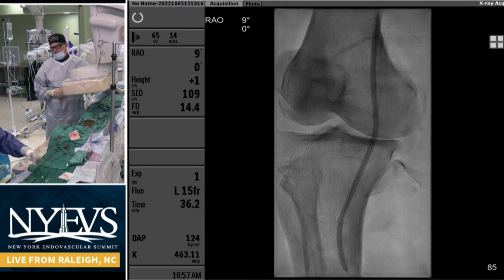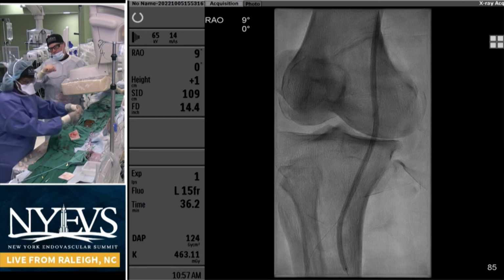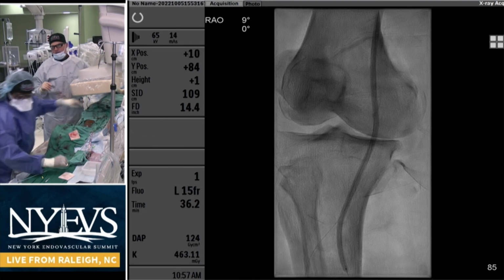Yeah, so in terms of your question, I took the wire from below and I went into the anterior tibial. So I know I'm in the same channel. That's the first thing. Second thing is, once we leave the drug-coated balloon up for 3 minutes, I'll bring it down. And if it looks good, I'm just going to Supera from the P3 segment back to the P1 segment for sure, and then see what it looks like from there.